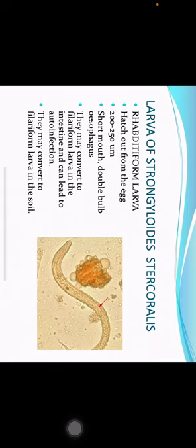The rhabditiform larvae hatch out from the eggs. The rhabditiform larva is about 200 to 250 micrometers long. It has a short mouth and double-bulb esophagus. The rhabditiform larvae may convert to filariform larvae in the intestine, which can lead to autoinfection. They may also convert to filariform larvae in the soil.